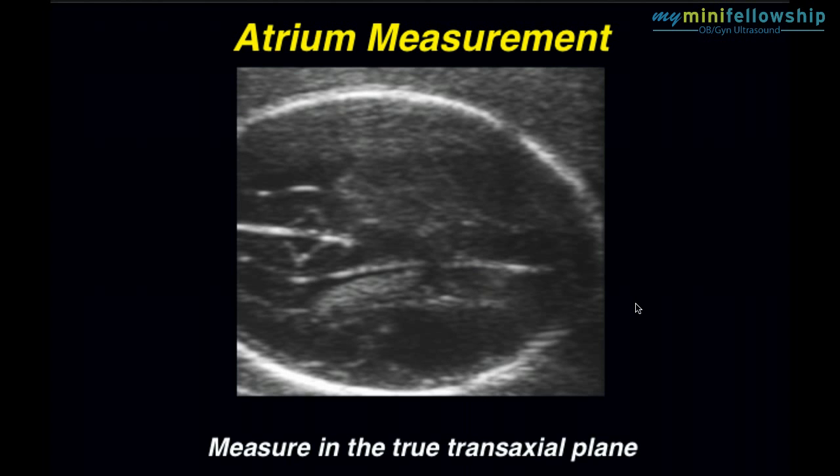How do we know we are making our measurement in the true transverse axial plane? Well, we run into a problem here with in utero sonography because near field reverberation artifact causes us to be unable to compare symmetry of the brain as our certainty that we are looking at a true transaxial plane. Therefore, we must look at symmetry of the calvaria. The more perfectly symmetric the calvaria, the more certain we are that we are looking at a true transaxial plane.